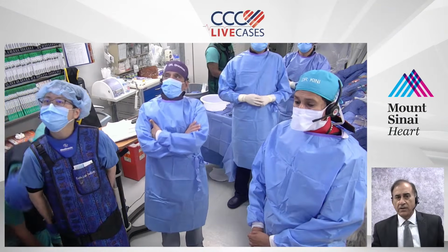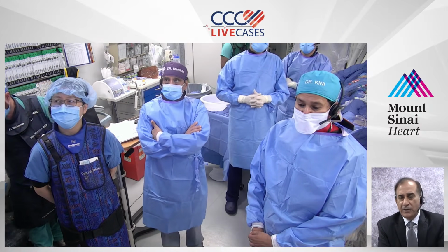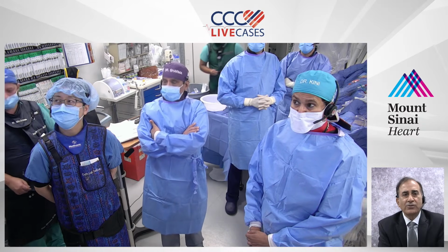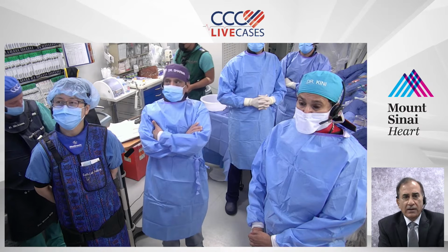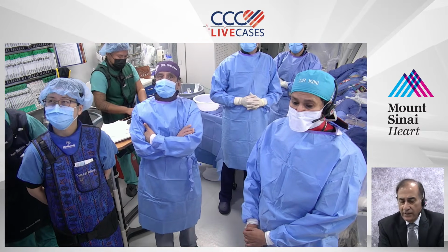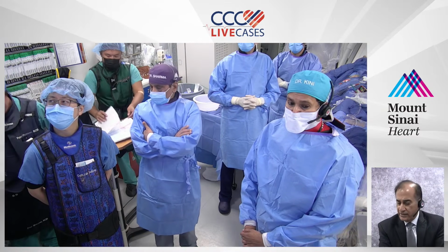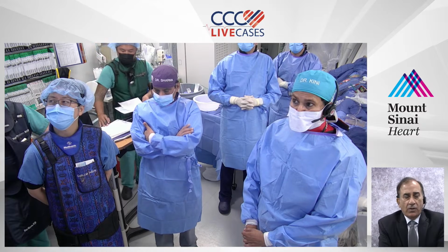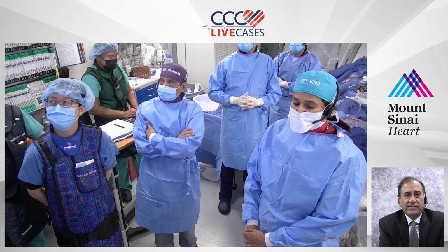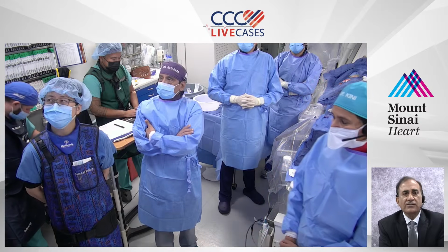Samin, such a wonderful, comprehensive review. I think I'll go back to it many times. Today's focused review is exactly relevant to the case which we showed. Everything changed with imaging, our strategy, our plans. I have a follow-up question regarding a one stent strategy for the provisional group. What if you have significant plaque shift, which changes everything? Would you then proceed with the second stent or stay with your initial strategy?